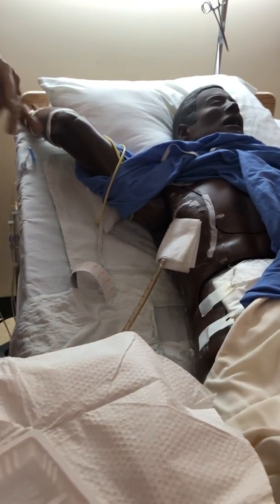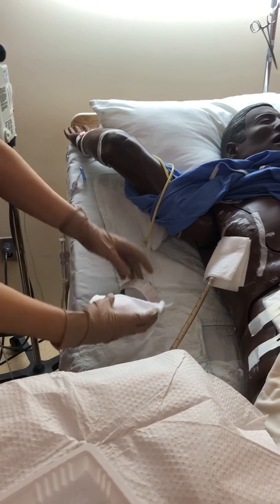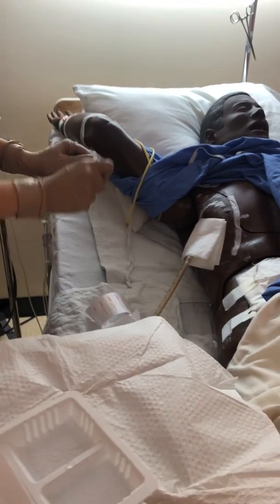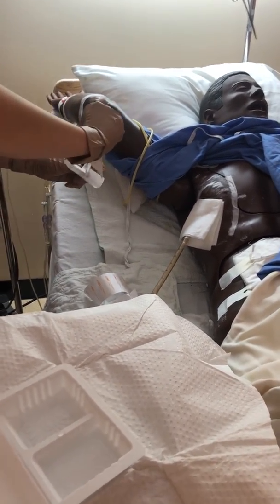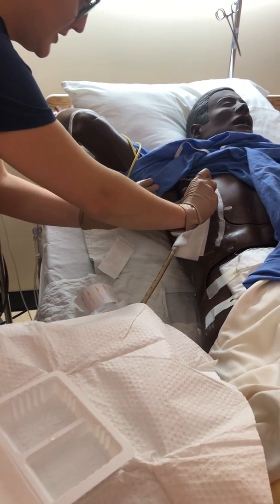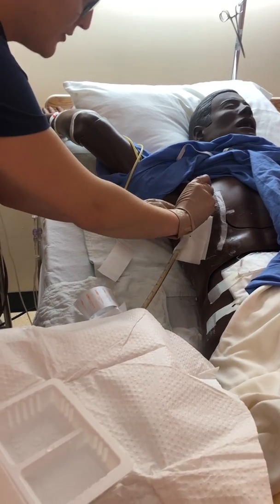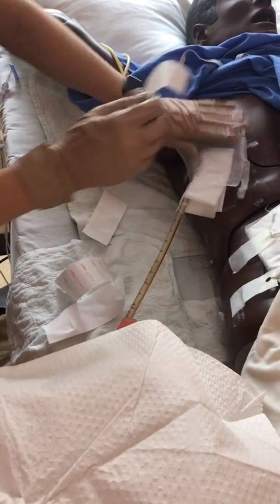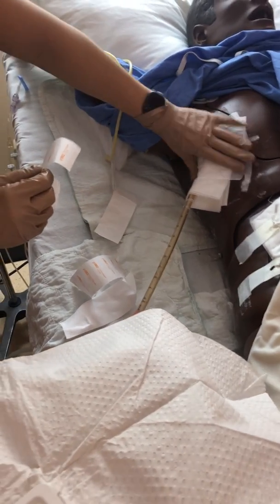So this part is no longer sterile because I've touched it. So I'm going to discard that one, and I'm going to get a second one here because we want to maintain everything under the dressing sterile. So I'm going to pull that apart again, keeping this sterile here. I'm just going to touch this gown, so that would again not be sterile, so I would get a new one, but for demo purposes, we're just going to keep going with this one for time. So I want to make sure this is all occlusive and tight, good.